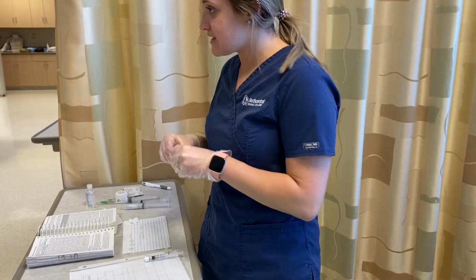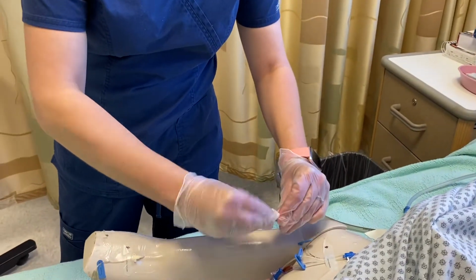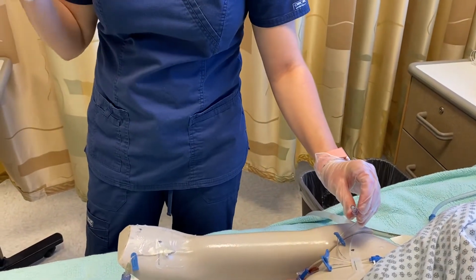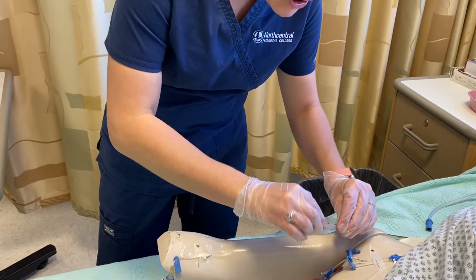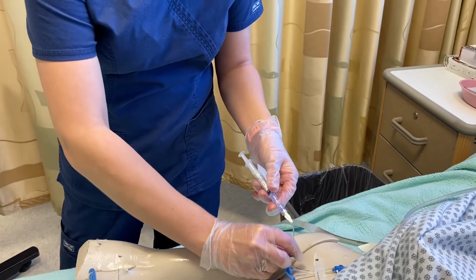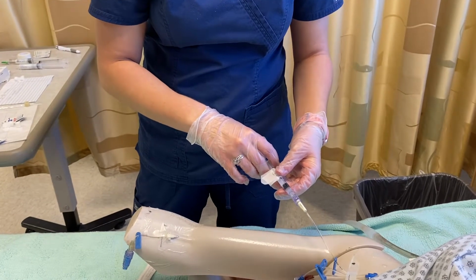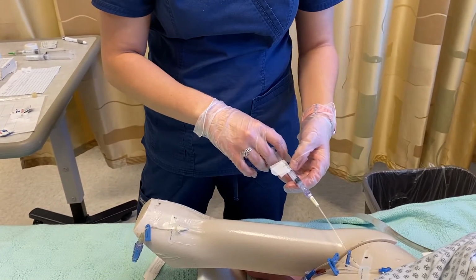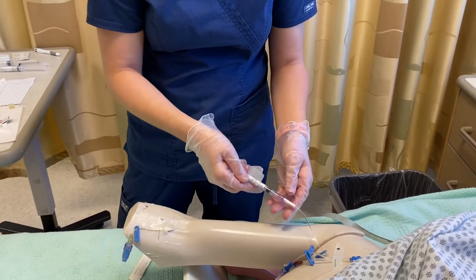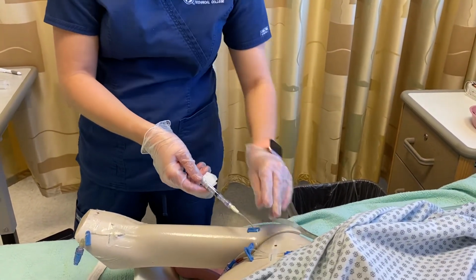So, let's take another alcohol swab. Clean the port again. Take this off. Attach. And like I said, we're going to unclamp this. We're going to give it over 2 to 5 minutes, but for video's sake and time's sake, we're just going to say I'm giving this over the prescribed amount of time. Watching for any adverse reactions. I'm going to clamp this. Bob, you doing okay? He says he's great.